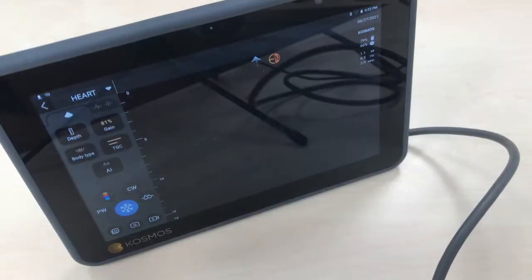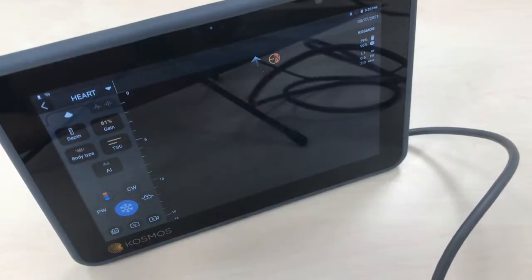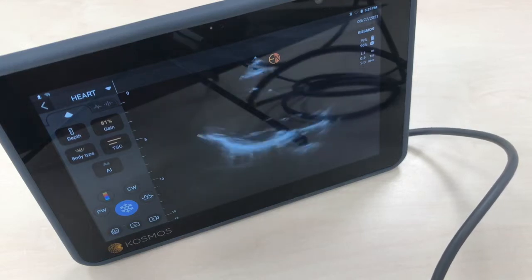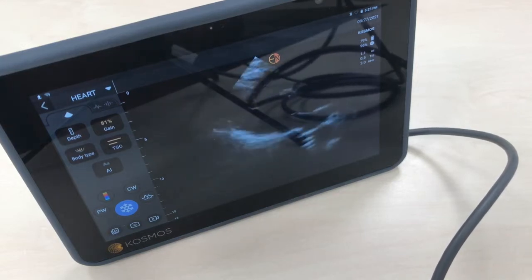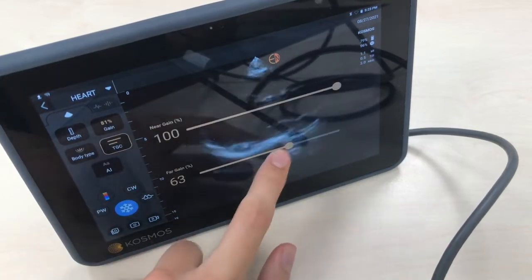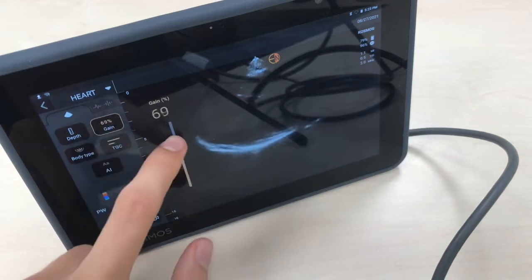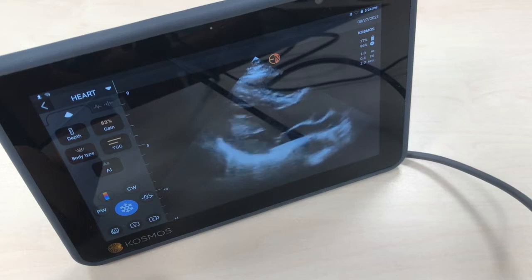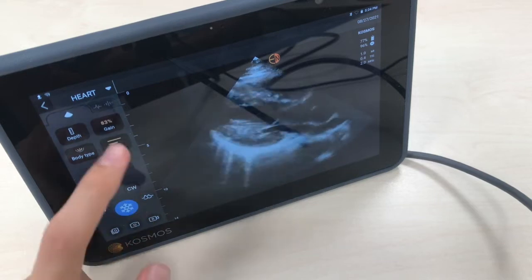Now let's do a live demo on myself. Bear in mind that I'm sitting on a chair, so the views won't be optimal. Let's start with a parasternal long axis view. As you can see here, this is the parasternal long axis, and the image quality is really good.